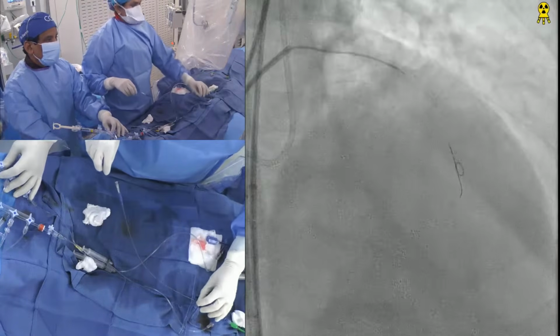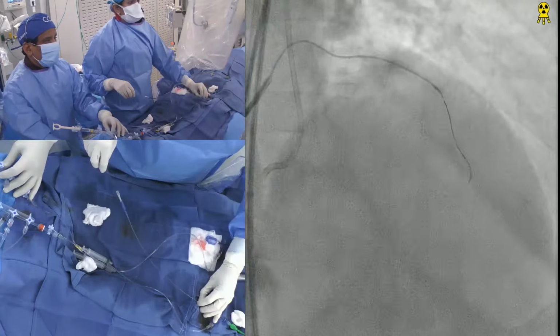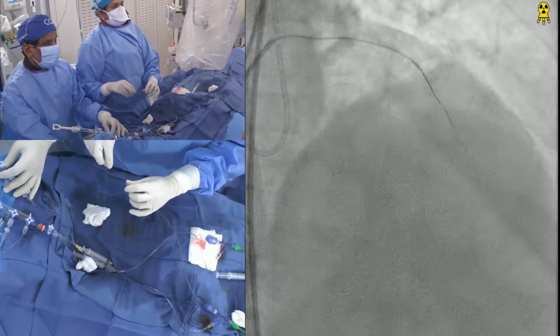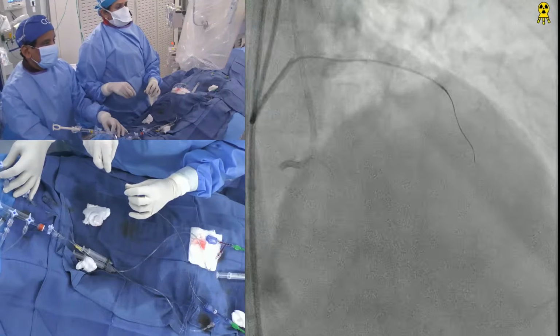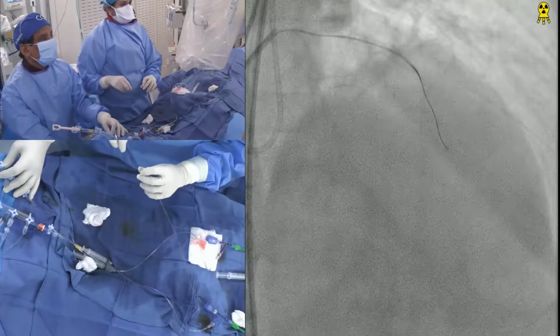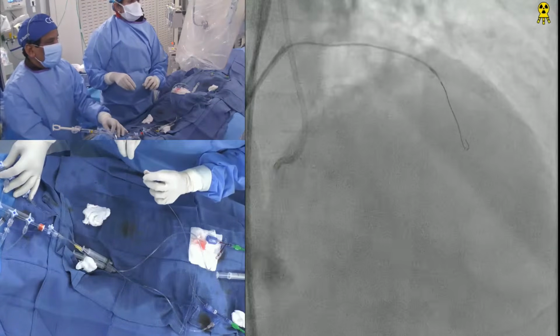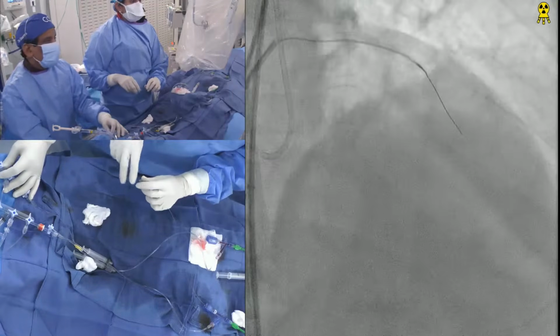Kept going in some. We jinxed it just by calling it a good direction. Right now it's not the stent that's not allowing it. I tried to get into the subtle proximal one through the stent strut, would not go. But the connection was not much there anyway. The issue is we may not get the Corsair all the way down.